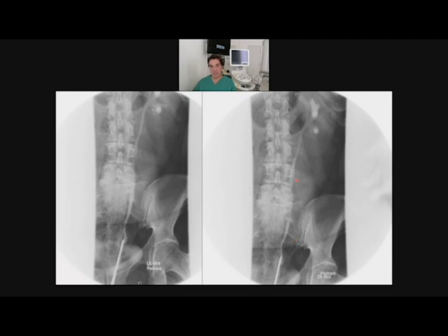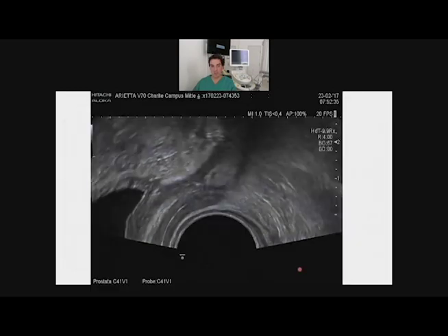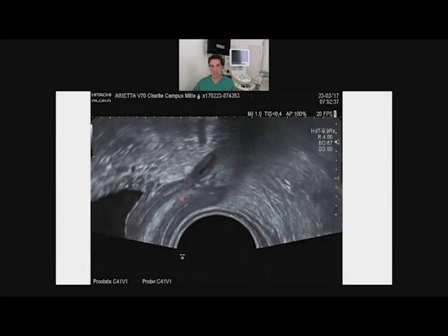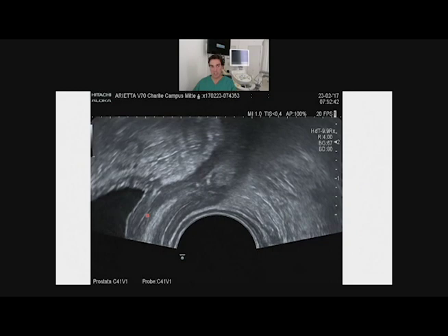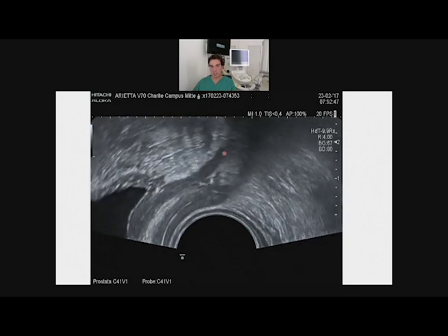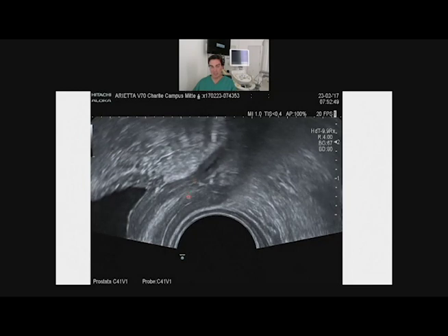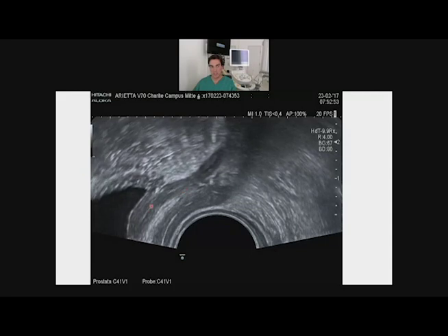2 months later, we bring the stent out and you have no more leakage. The ureter places itself to the other end and it comes together without any stricture and so on. In ultrasound, you see it really clearly. This is the total ureter and you see the fluid coming, and this was the part where there was a bridge. The ends of the ureter come to one another and you see the fluid come through without any stenosis.